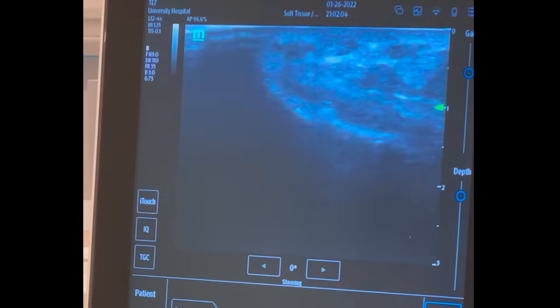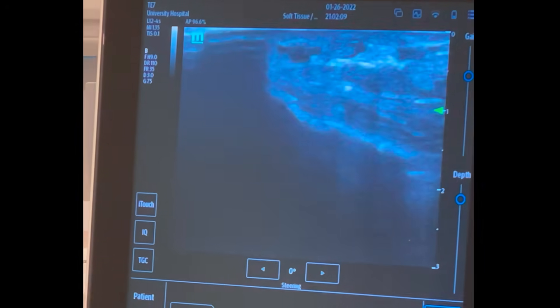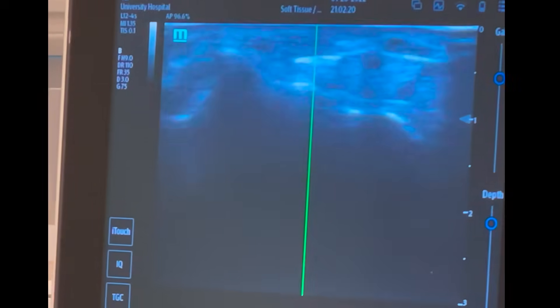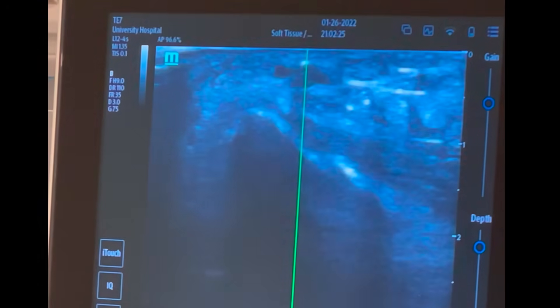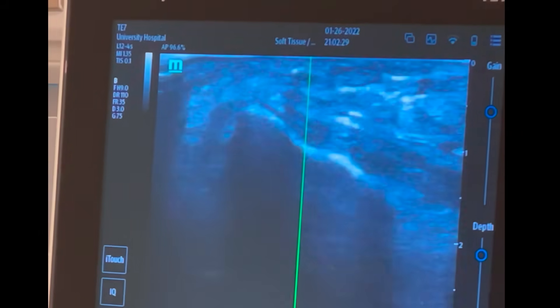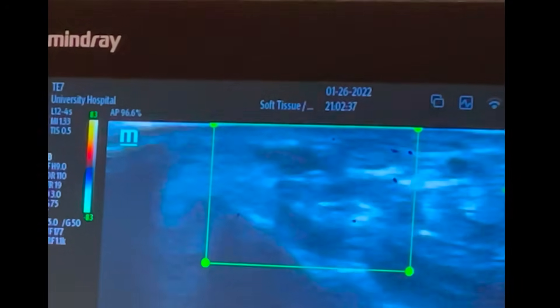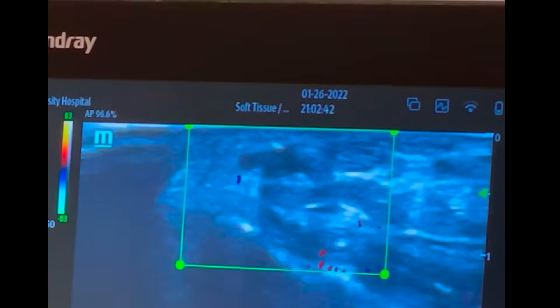If we look at the ultrasound machine here, right there in the center of the screen on top — with two veins, we try to compress it and you see the two veins on either side compressing. I'm going to line it up in the center with the M-line. We compress the radial artery and we can also turn color flow on to see if we have pulsatile flow through it — and here again we see pulsatile flow through it.